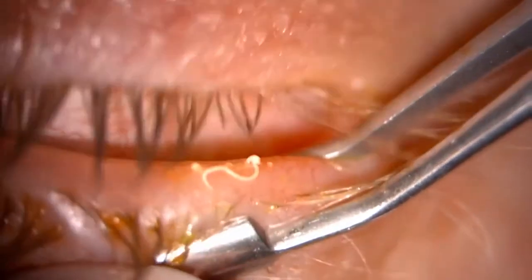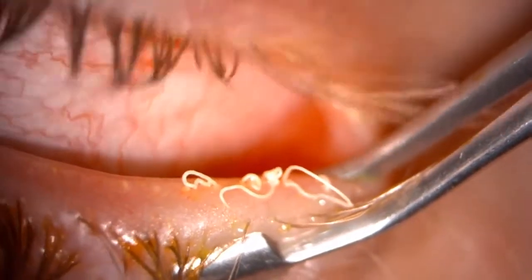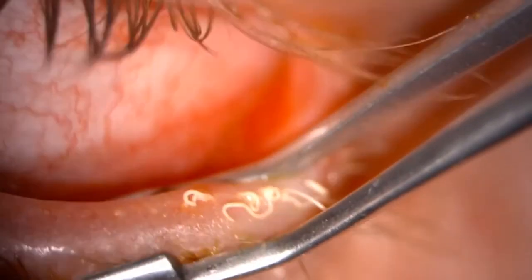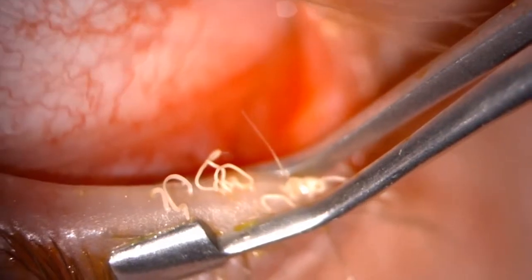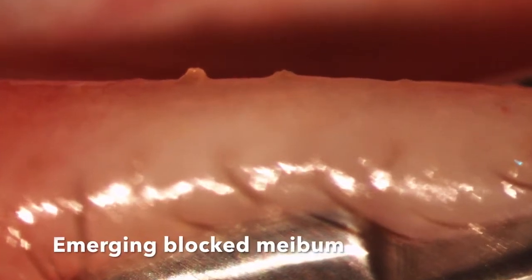Here we have an example of quite a severe blockage with very thick meibom coming out of the glands. Even though it's so thick, with the pressure you can exert with the forceps it does come out quite easily. Here we can see the meibom as it's emerging from the blocked glands with pressure.